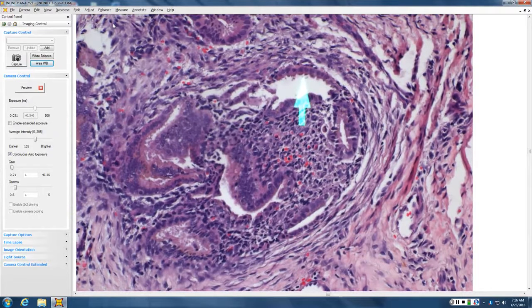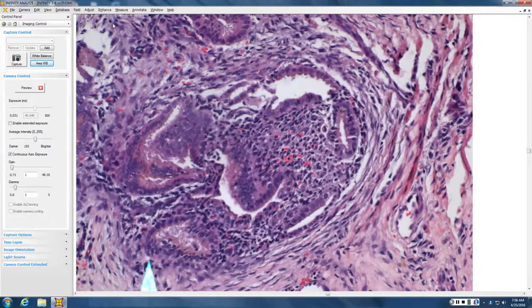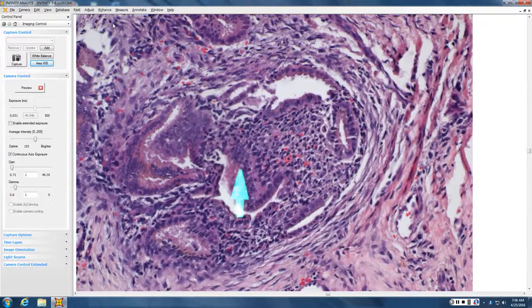So it's pyknotic nuclei largely in the center, although you can see some neutrophil type inflammatory cells. So here you have a columnar epithelium, seems to have kind of a decapitation secretion thing going on. It has a stroma, and there's lots of red cell extravasation within the stroma.